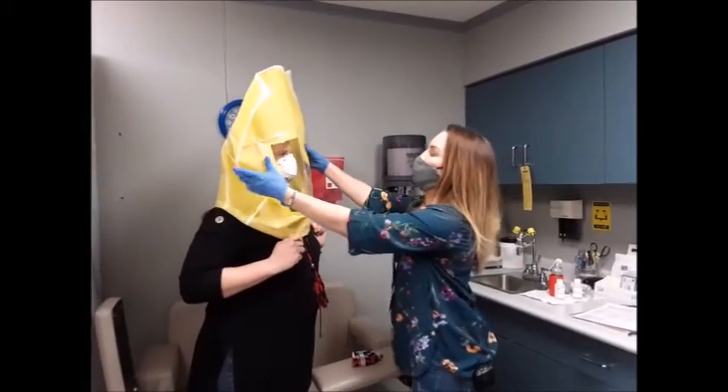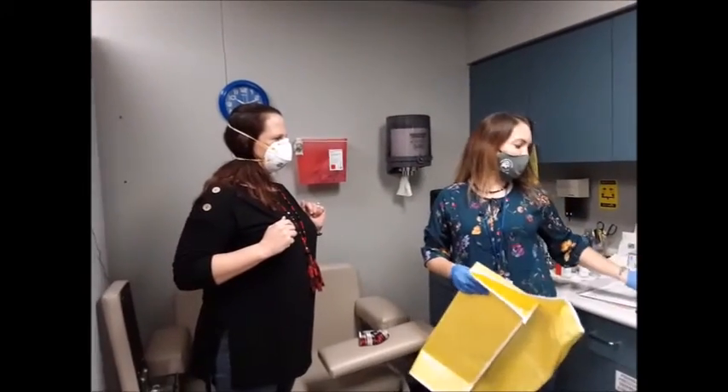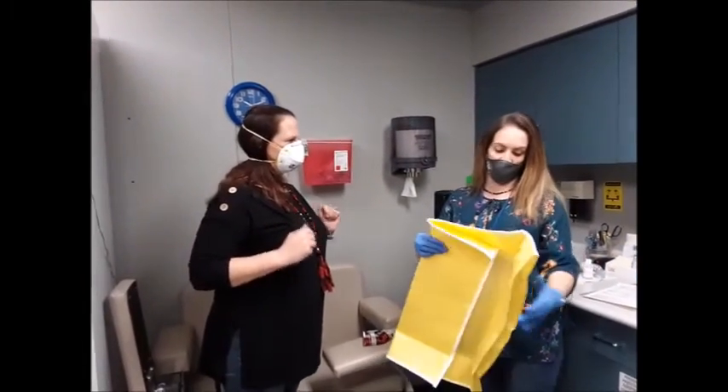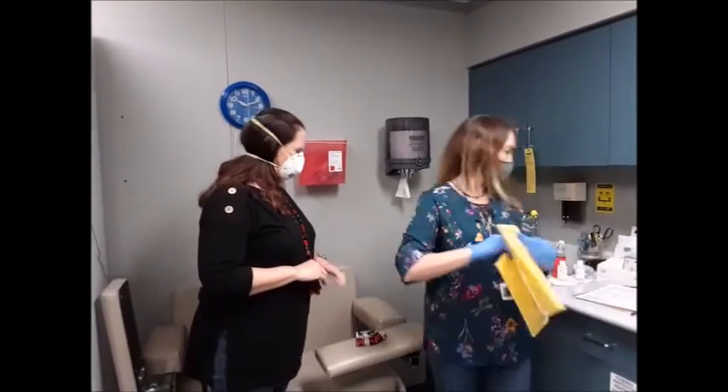Then that means that is a good fit for you. And that mask, I'm going to have it written down for you — it's an 8210. And if you need to know your size, just call us and we'll get you another size. Thank you. You're welcome.